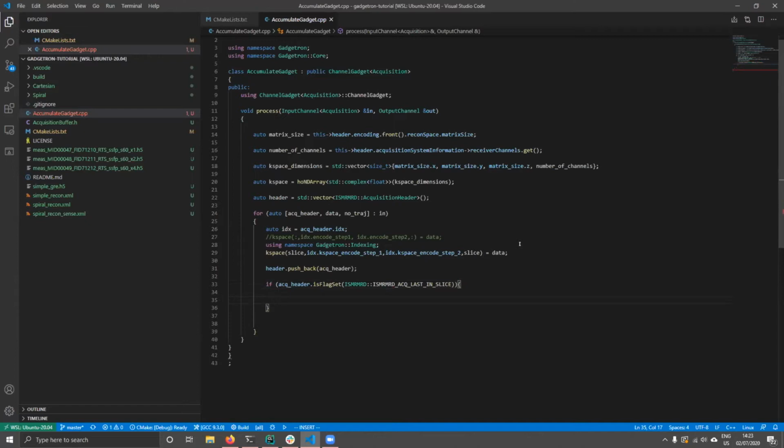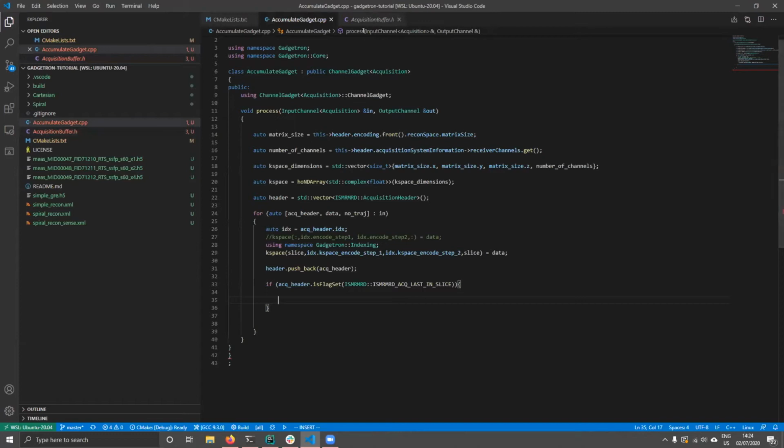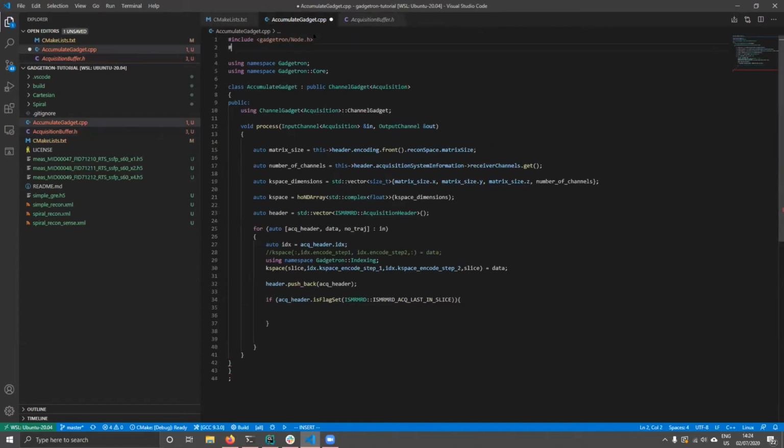But what do we want to send on? Well, I prepared, in the best TV chef manner, a little structure here, which includes an HoNDArray, data, and a vector of headers. So we could put anything in here. Like you could put functions, you could put anything that can be copied, really, that can be sent from one gadget to the next. But we're going to use this acquisition buffer.